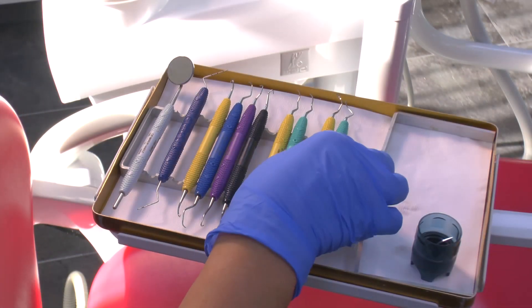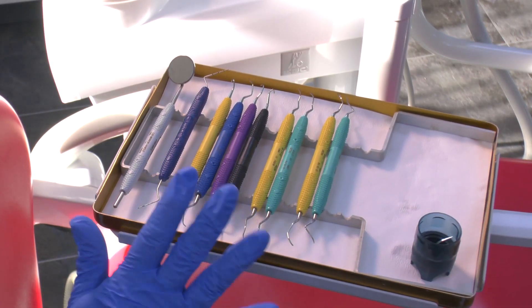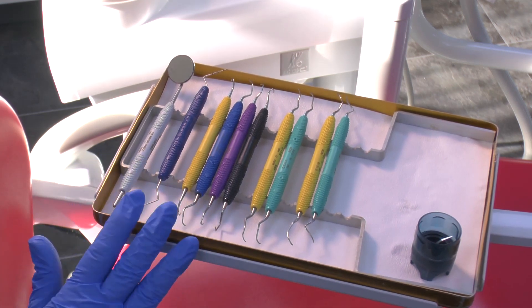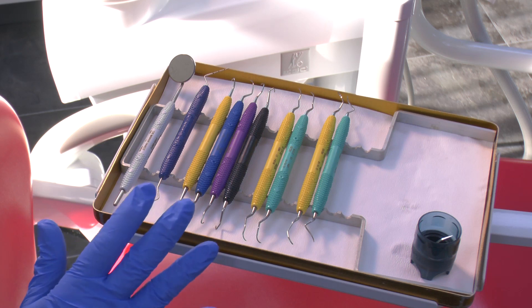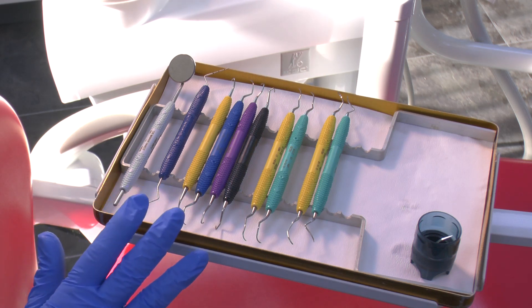This kit is the kit that has most instruments one would need for doing the hand instrumentation where patients have got deep periodontal pockets.